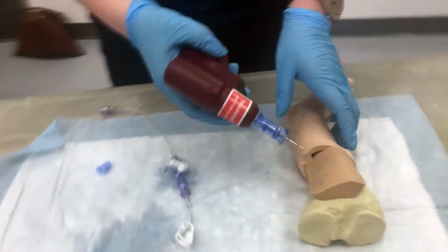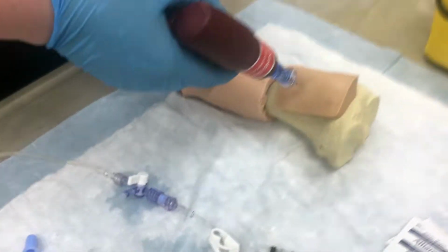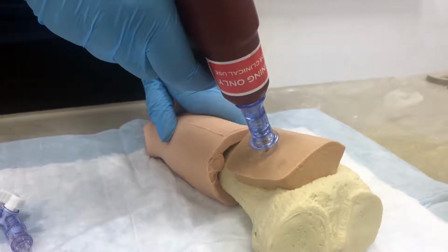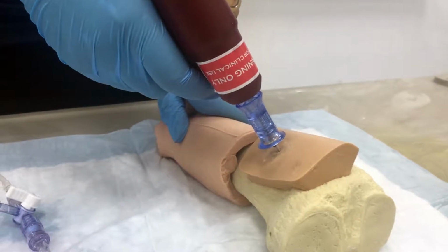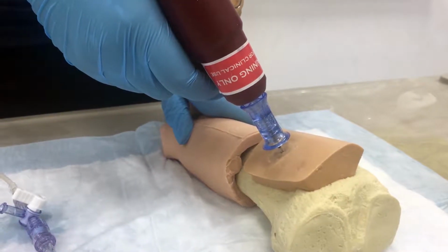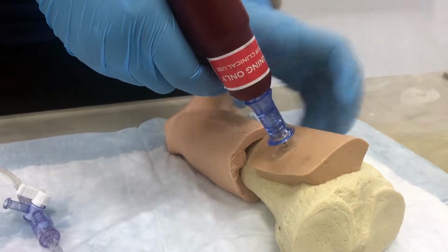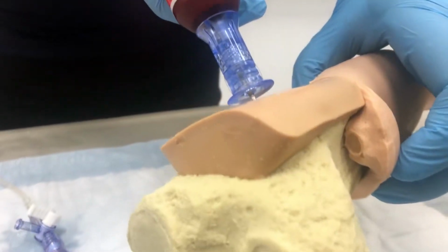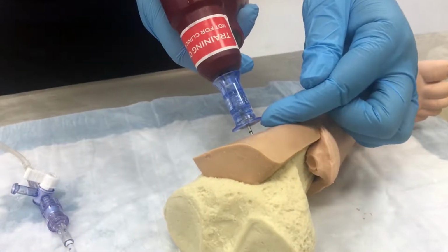Insert the IO needle through the soft tissue towards the bone at approximately 90 degrees. Direct the needle away from the epiphyseal plate in pediatrics. Push the needle through the skin until the tip of the needle touches the bone. 5 millimeters of the catheter, at least one black line, must be visible outside the skin.